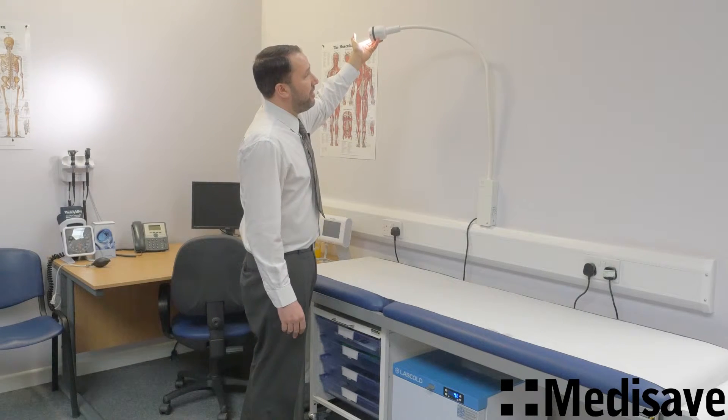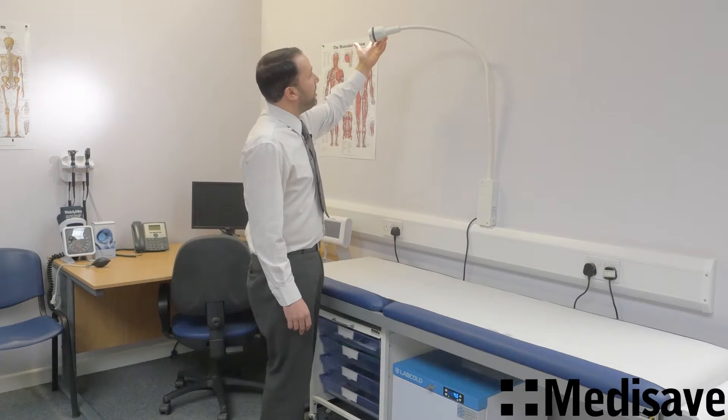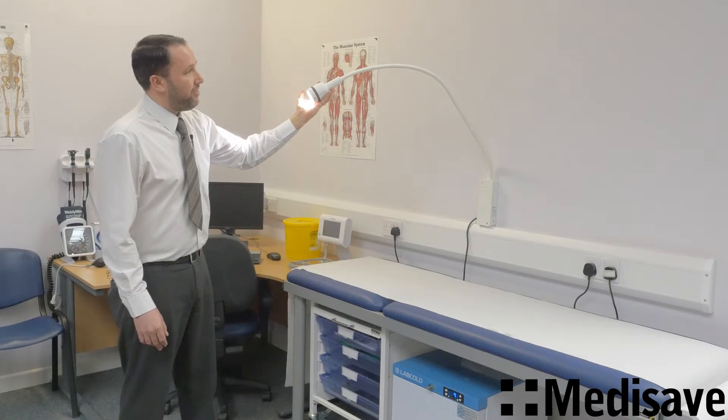This has the gooseneck and is guaranteed for five years. To tension it, you can bring it out to any kind of level and it should just stay where it is.